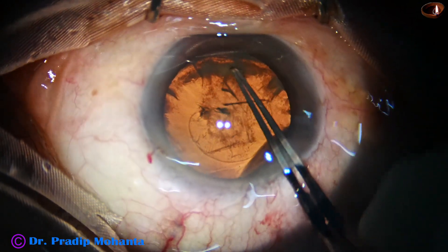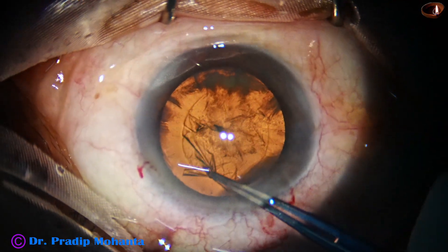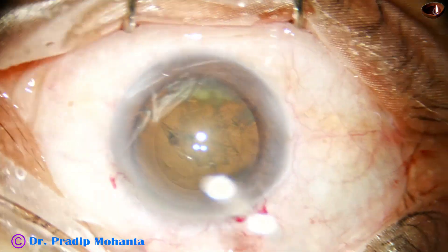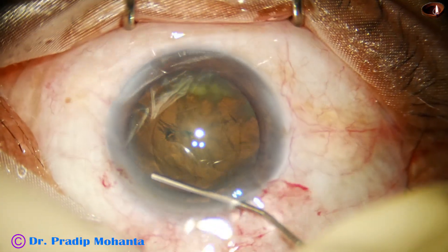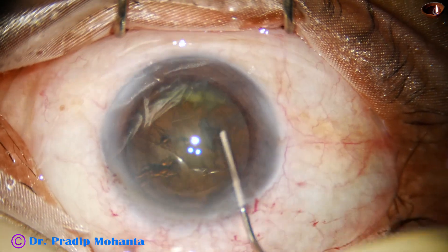Capsulorhexis is done with the help of a Utrata forceps; the size of this rhexis is about five millimeters. Hydrodissection is done with a syringe and a 27-gauge cannula.